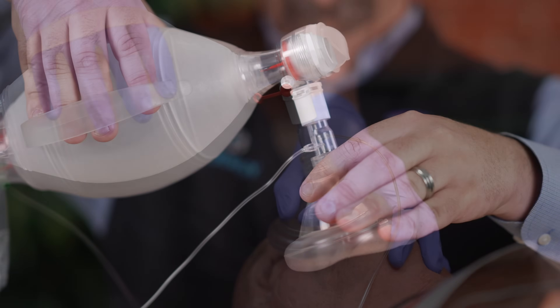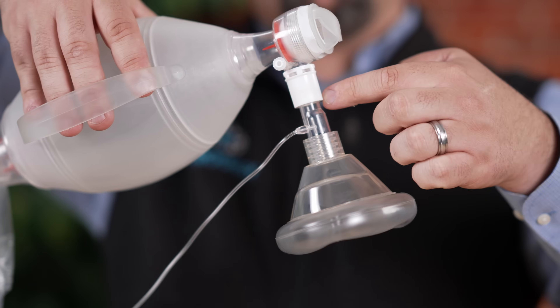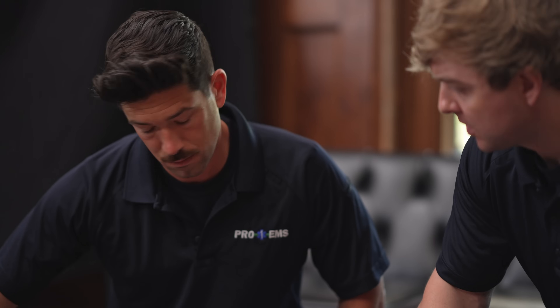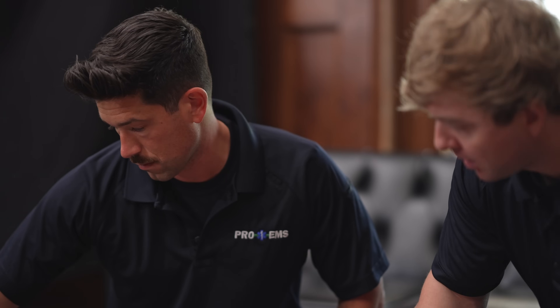One of the benefits of using the capnography between the mask and the bag in a peri-cardiac arrest patient is it allows you to quickly identify a drop in perfusion or even a loss of pulse by seeing that value quickly drop to zero, which would prompt you to check a pulse. It looks like we lost capnography.